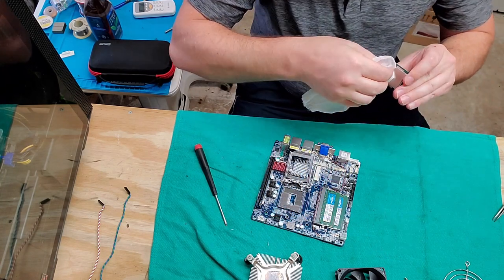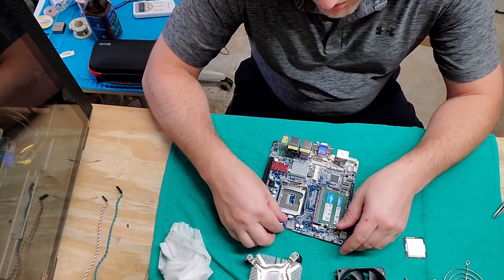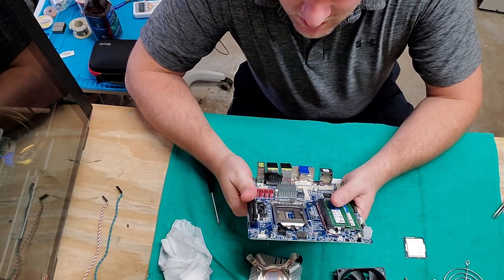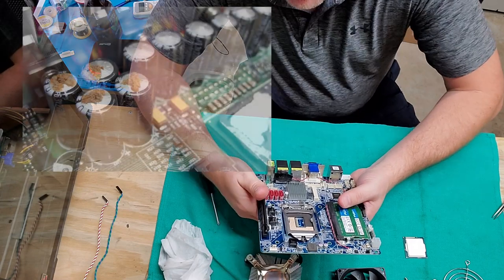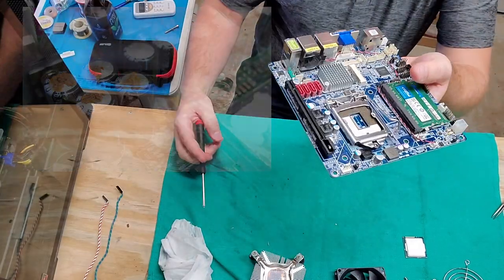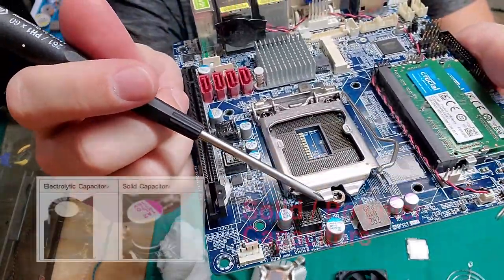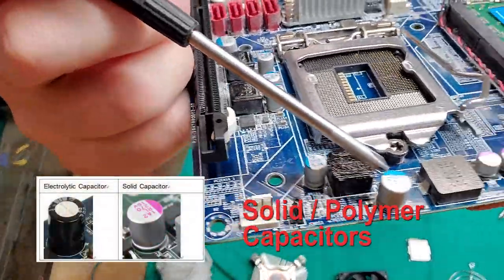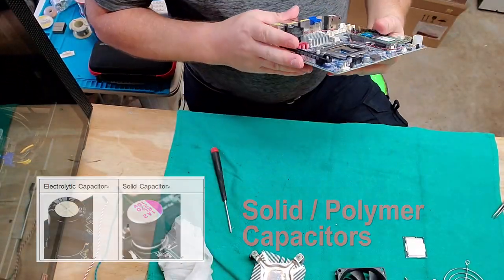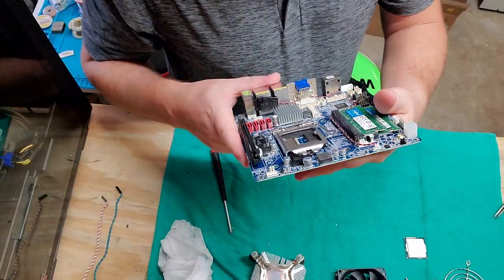But as I was saying, there's only a couple things that really normally cause a lot of problems with computers. One of them is going to be memory, one of them is going to be heat, and the other one is going to be these capacitors. They're usually around your CPU because they're power regulating. But this is kind of a special deal. It's got special capacitors. You see these ones right here? These ones are not normally known for going bad, and you can see some of the power phases for the CPU around the outsides.